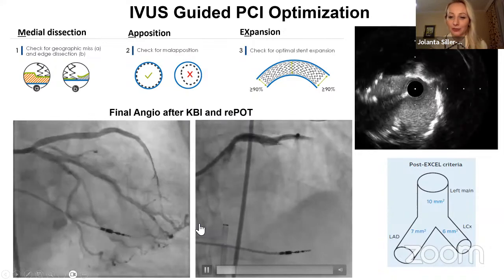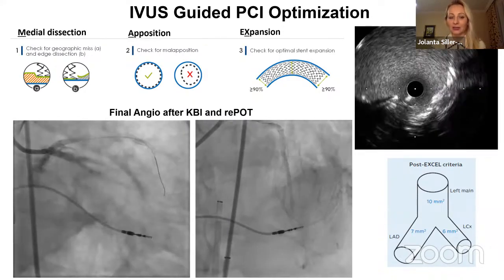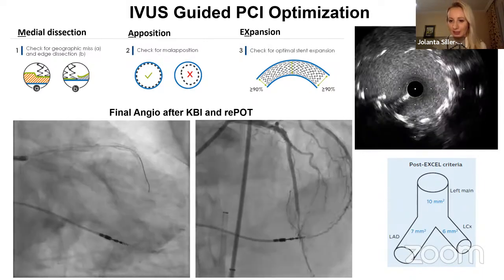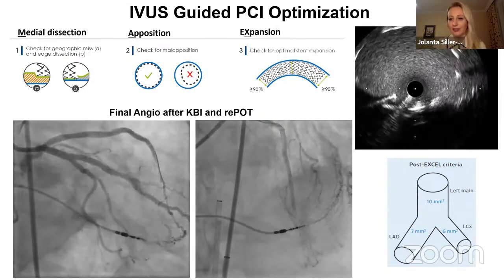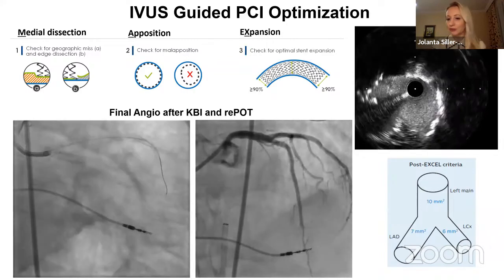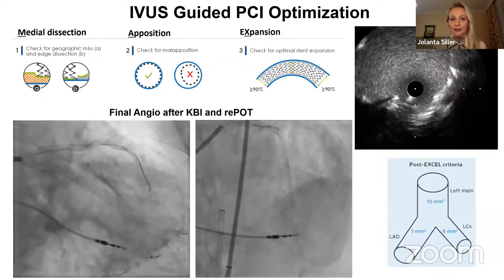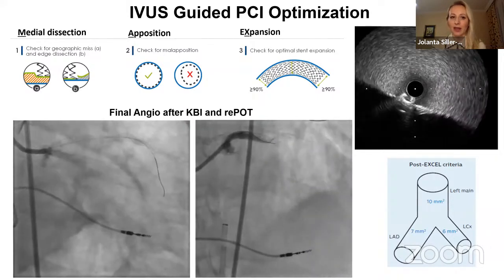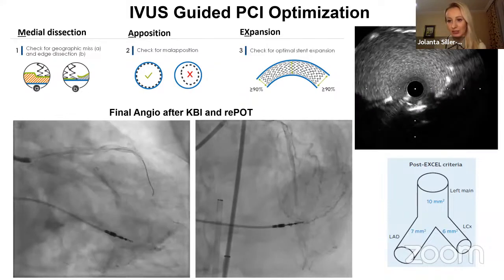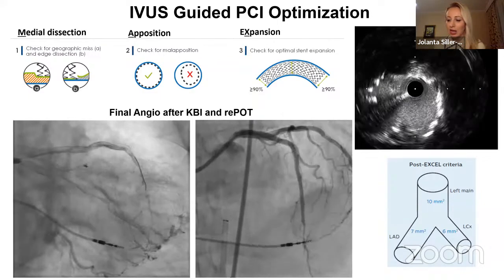What I think is very challenging in the clinical routine is the fact that those patients with a calcification are very sick. So very often they have renal failure, on dialysis, three-vessel disease. I had several cases where I always aim to do pre and post PCI imaging, especially with OCT, where I can gain more information.